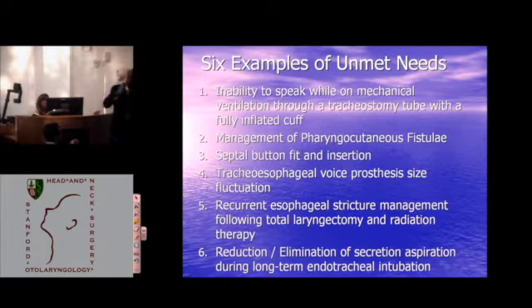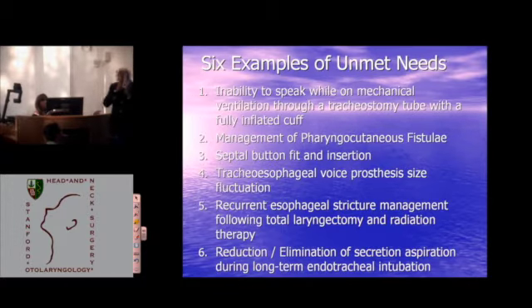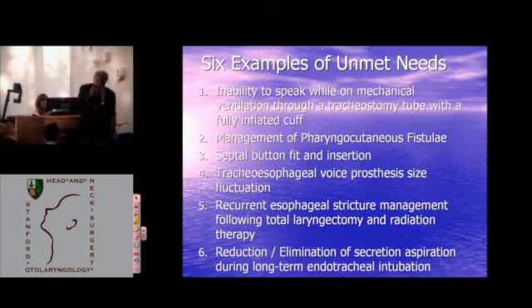Sometimes, depending on where the perforation is, you can get them in, put them in the office, but sometimes you have to take the patient to the OR to get them in. So that's a challenge, and I can tell you, there are still people in the last year or so writing about taking a mold of a perforation and building. It's just crazy. So I'm going to show you a simple thought. Again, not rolled out, but close to rolling out.